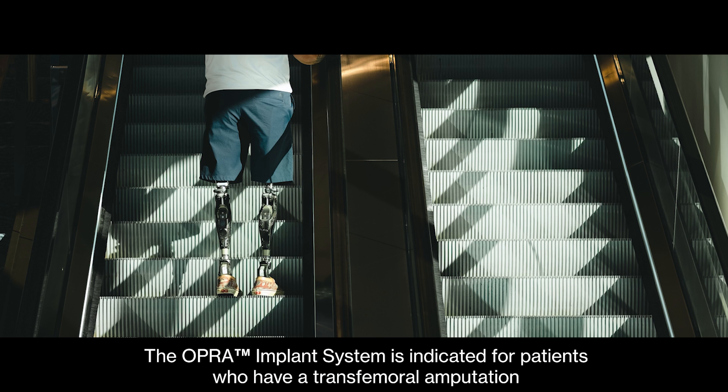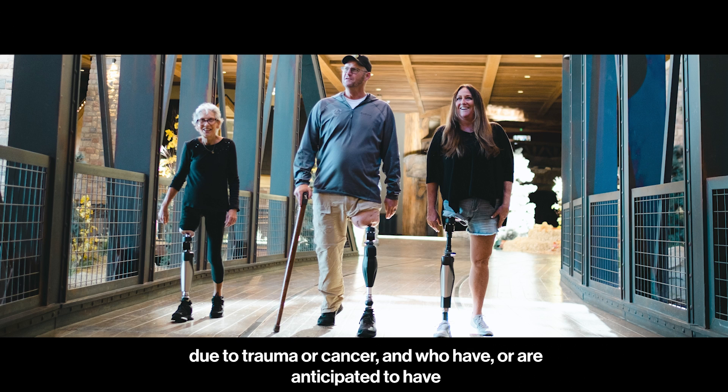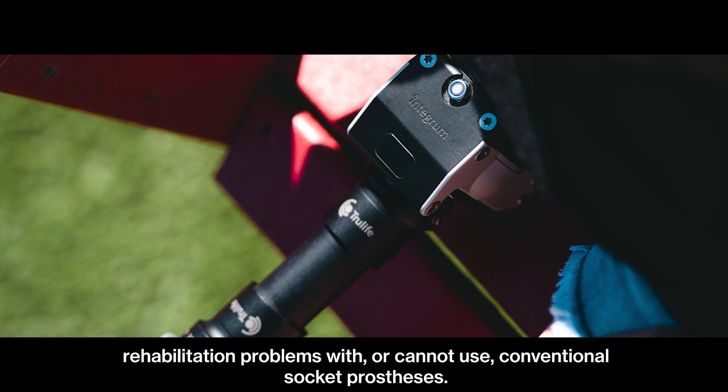The OPRA implant system is indicated for patients who have a transfemoral amputation due to trauma or cancer, and who have or are anticipated to have rehabilitation problems with, or cannot use, a conventional socket prosthesis.